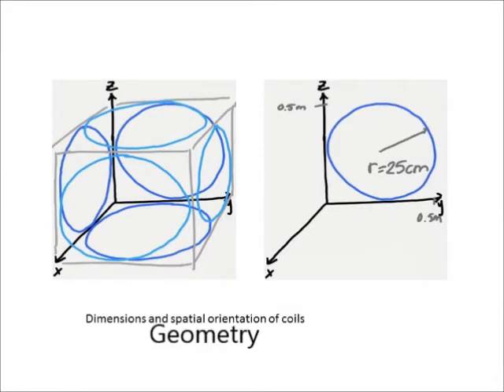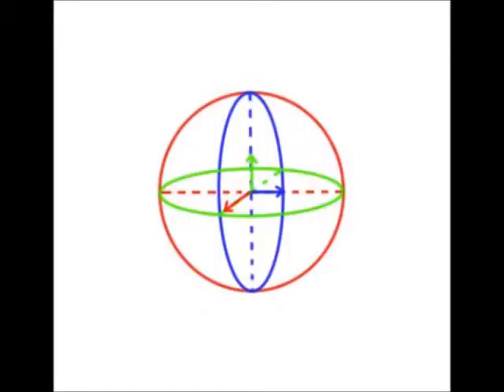Lower and upper boundaries of the solution are specified as the position coordinates can only be within the boundary of the human body itself. For simplicity, we defined the bounded region as a cube that would represent the human torso. The origin of the coordinate system is placed so that all of the points are located in the positive octant. All the external coils have a radius of 25 centimeters, and therefore we assumed the human torso to have a diameter of 50 centimeters. Therefore, the upper and lower bounds are from 0 to 0.5 meters in each direction.